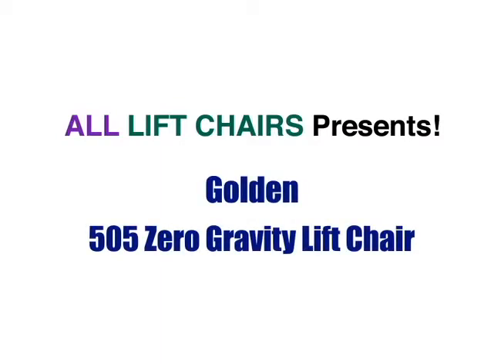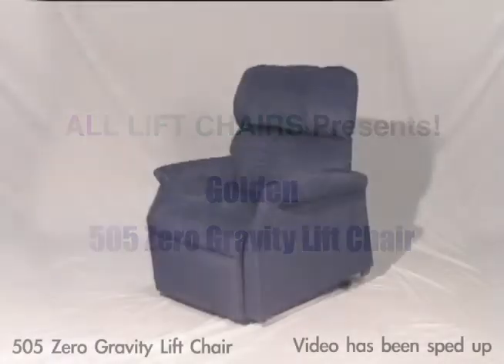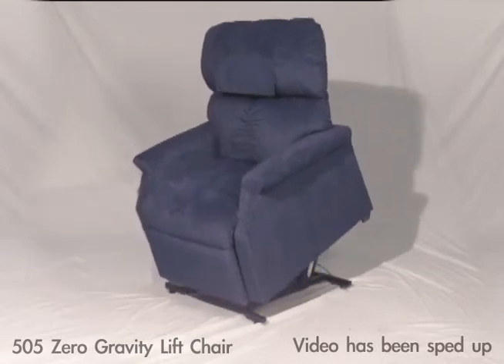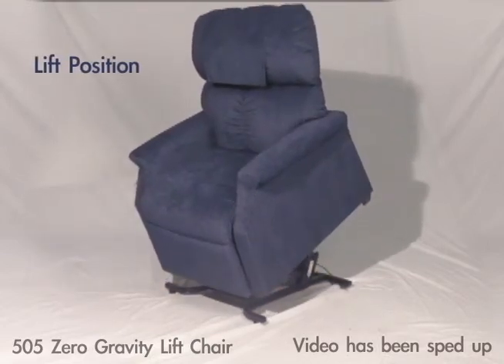The Golden 505 Zero Gravity Lift Chair is an infinite position lift chair that uses Golden's Zero Gravity technology. A zero gravity lift chair safely and comfortably lifts you into a standing position.